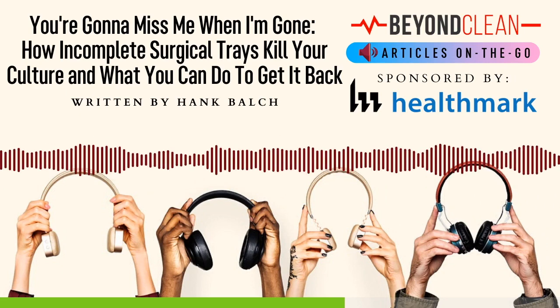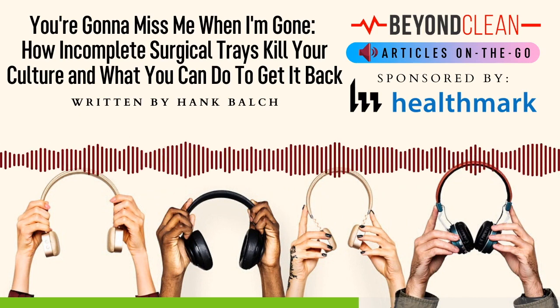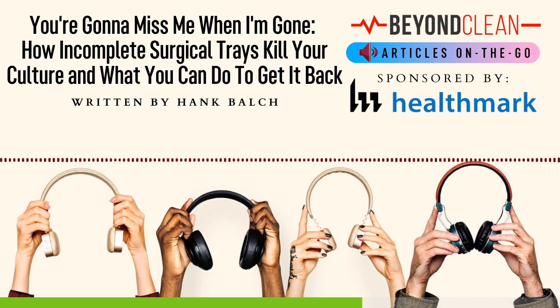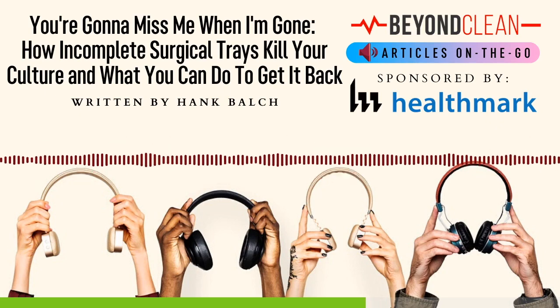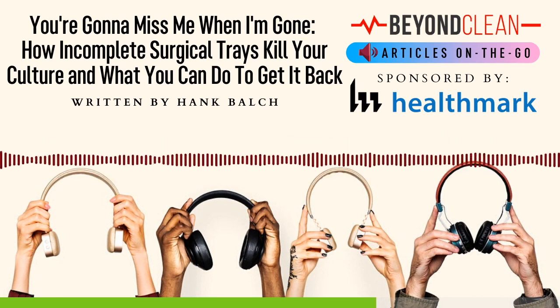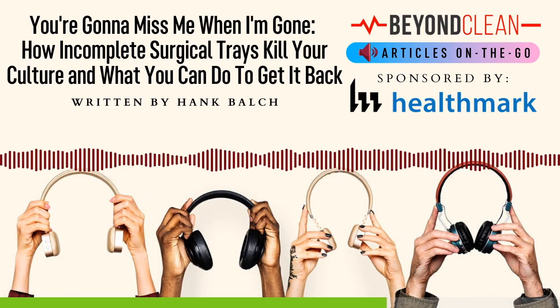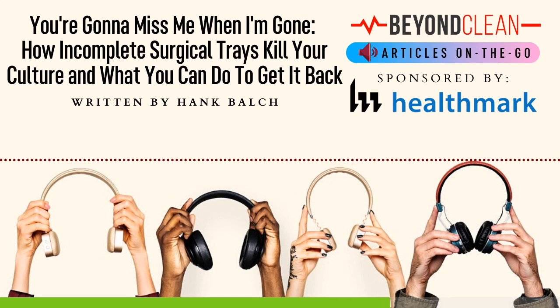Plus, you can really make a bin system look sharp if you want to. The cultural impact of an organized backup inventory can mean the difference between a tech who happily spends 20 seconds finding the exact needle holder they need and a tech who begrudgingly leaves their table for a 10-minute excursion to the graveyard of productivity, a.k.a. the rat's nest of a backup wall you have. Don't make your techs choose between a productive night and completed surgical trays. They should want and be able to do both.